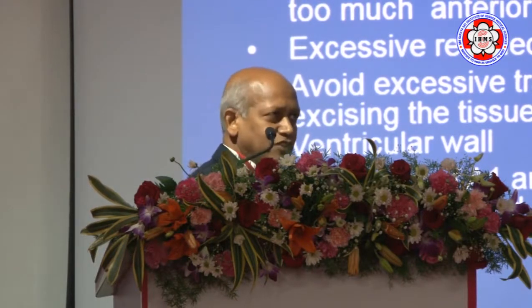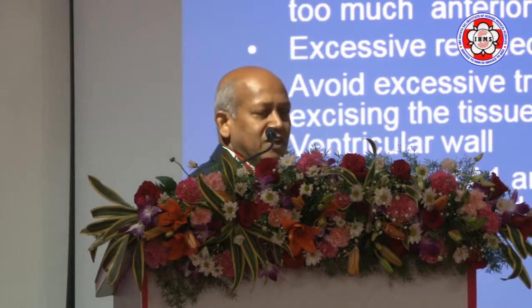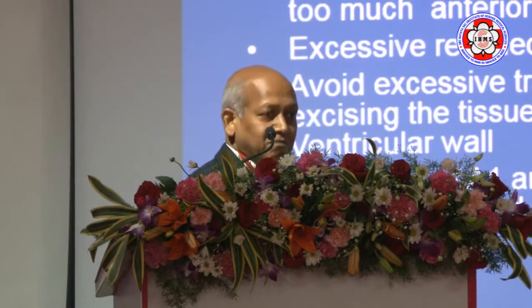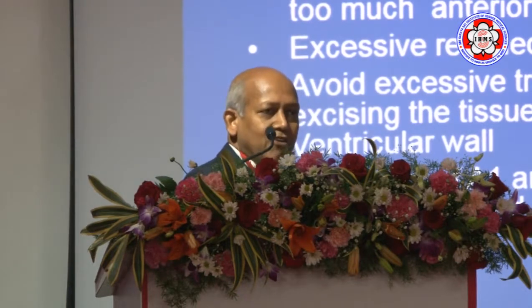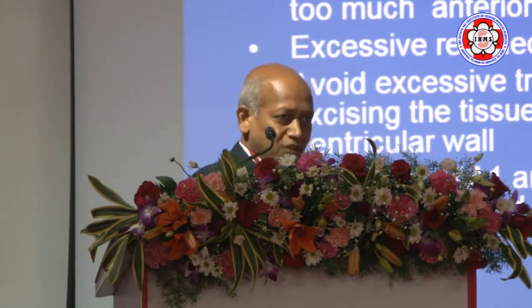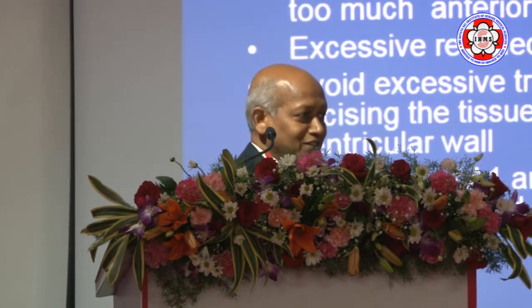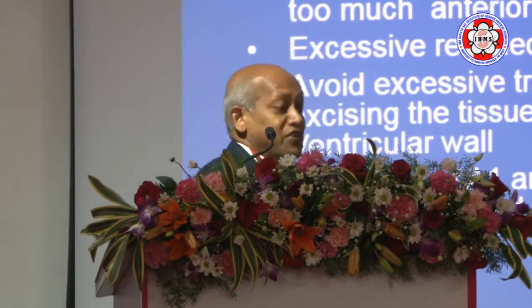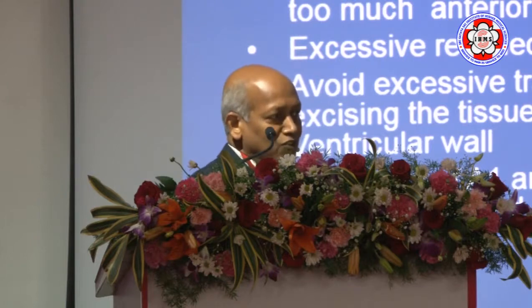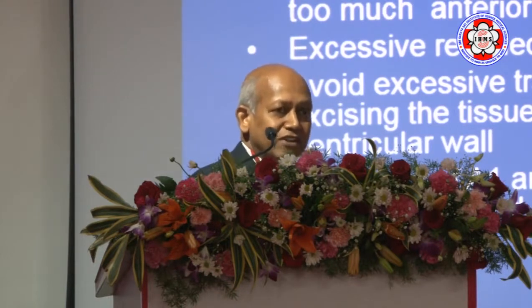I did 4 grafts on this patient and put in a mitral valve prosthesis, and the patient was not doing very well. At the beginning, before her echo, we didn't have an understanding. So we had an echocardiogram and found out she had severe LV obstruction. So on the third day, I took her back, took out the valve prosthesis, took out the anterior leaflet, and replaced the valve. It's my own personal experience. That's why I always say, do not leave too much of the anterior mitral leaflet.